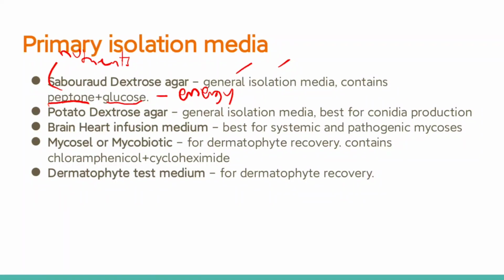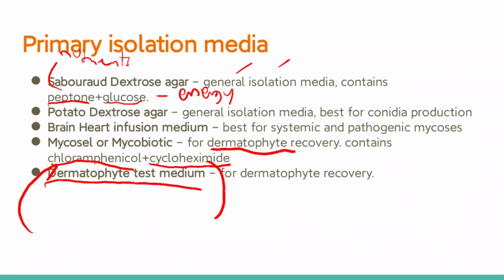This is for dermatophyte recovery because it contains chloramphenicol and cycloheximide. Tatandaan nyo, no? Chloramphenicol, antibiotic. Cycloheximide, anti-saprophytic fungi. Okay? Para dermatophyte lang yung tutubo. And lastly, we have the dermatophyte test medium. Same goes, this is also for dermatophyte recovery.